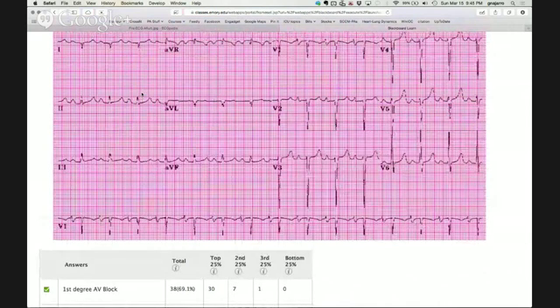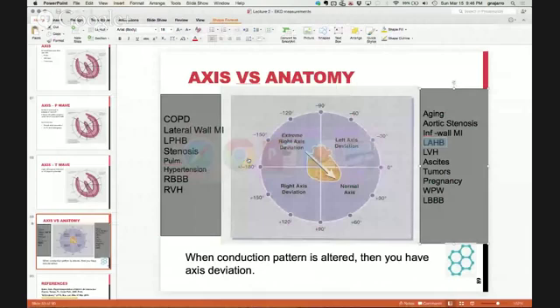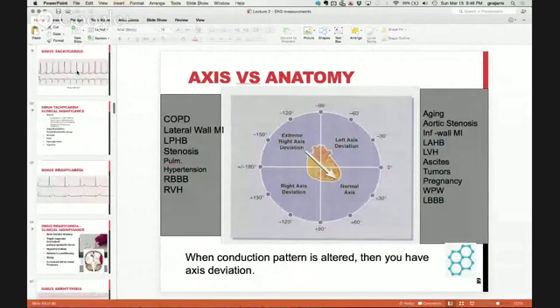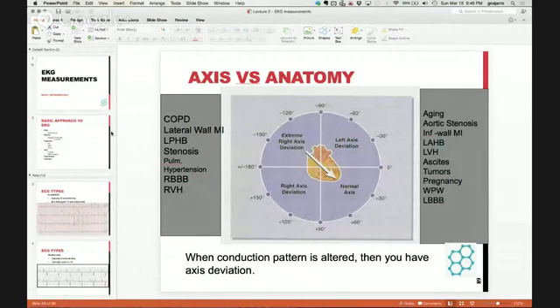Okay. The amplitude of the QRS is going to be more proportionate to the size of the ventricular muscle, right? And again, we'll go over this in the hypertrophy talk on Wednesday. But the size of any electrical wave you see is directly proportionate to the amount of myocytes that are generating that electricity, right? I briefly touched on this in, I think, the very first talk, when we talked about waves.